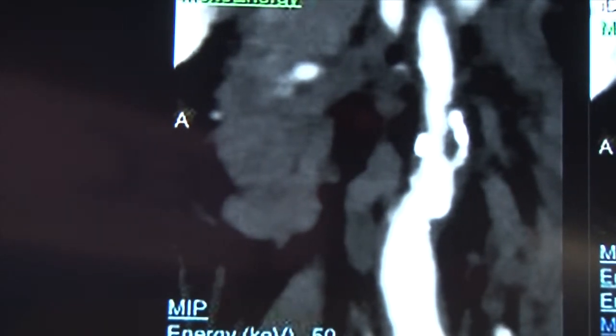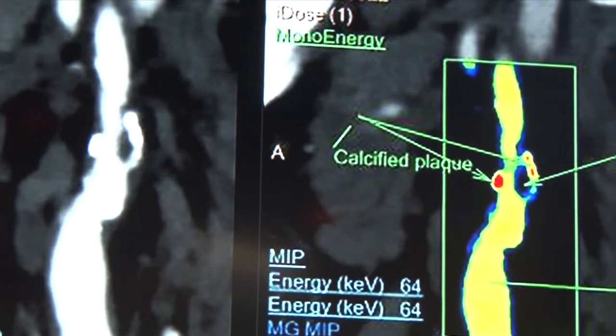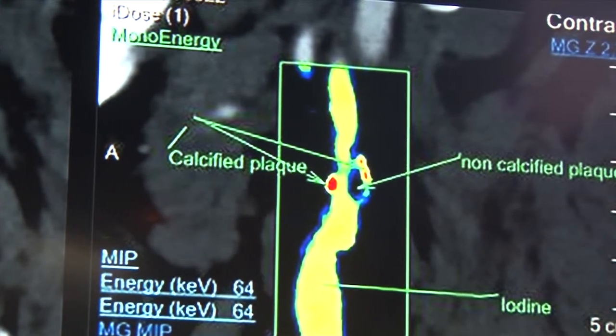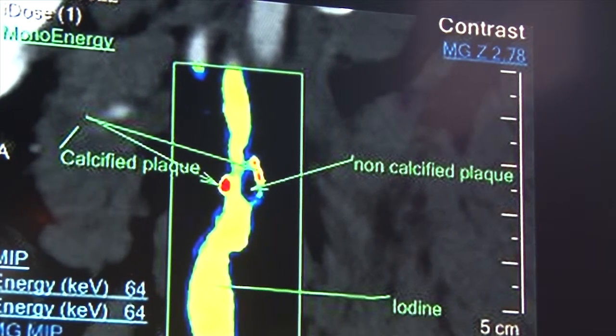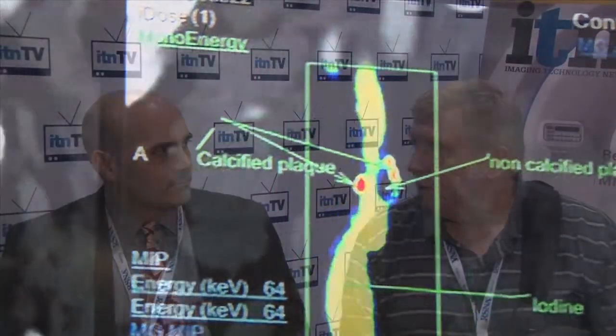Spectral CT's been out with a couple vendors out there, most notably Siemens, but Philips is taking a little different bend on their technology, where they're really pushing the spectral side of things. Similar to a light that is shining through a prism, where you have the chemical makeup that's made up with the colors that comes out the other side. You could do something similar using photons in X-ray systems, where the CT system, with this new detector that they have, can figure out the atomic number of the elements off the periodic table. So you can pull out specific chemical elements such as iodine using contrast agents, and also calcium that you may find in vessels. And you see that what they're looking at in that is really that spectrum of data that's available from a wide spectrum of X-rays that they have.